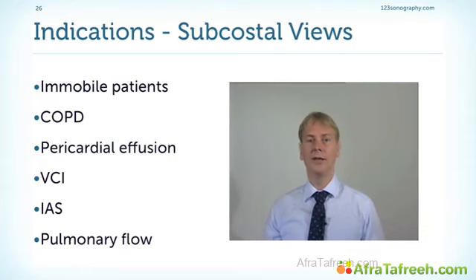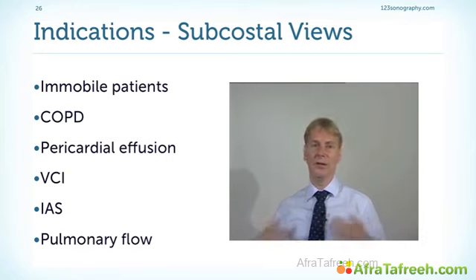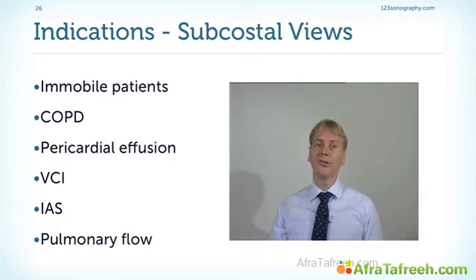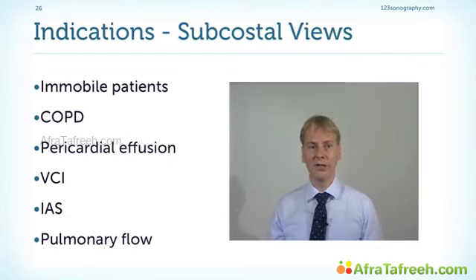So in summary, what are the indications for the subcostal view? I would say you should perform a subcostal view in every patient, but in particular in those patients where you have suboptimal image quality from the other views. Also very important in patients who have bad image quality due to chronic obstructive lung disease. Very good to look at pericardial effusion, perfect to look at interatrial septal defects and PFOs. Very good also to look at the pulmonic flow and to assess problems associated with pulmonary hypertension and other diseases.